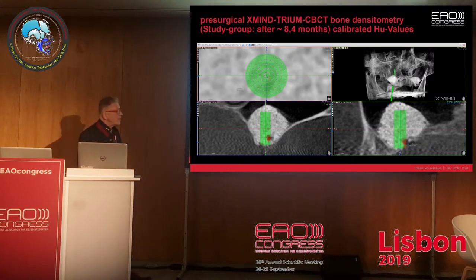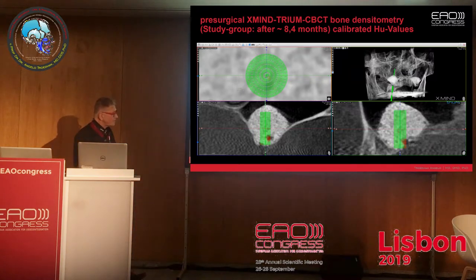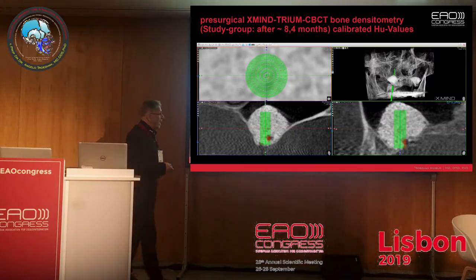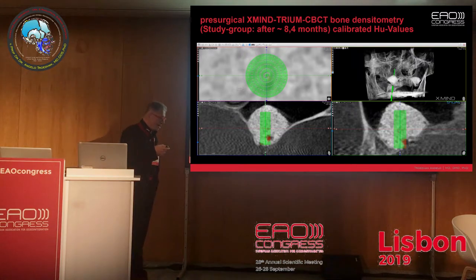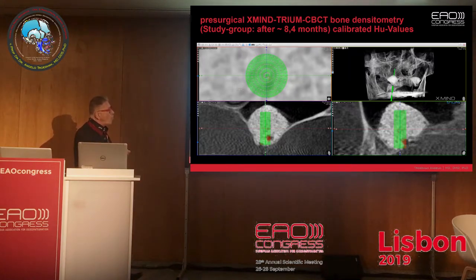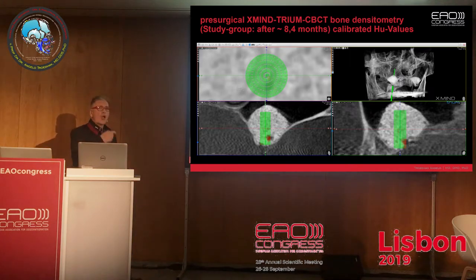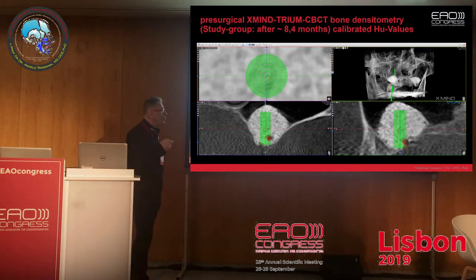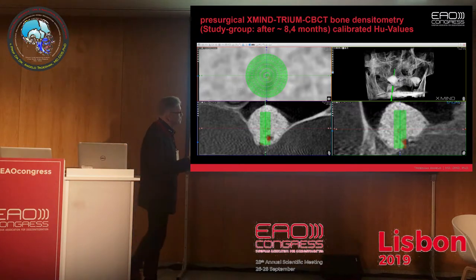Immediately before we inserted the implants, both in the study groups but also in the group presenting native bone, we investigated the bone density exactly at the spot where the implant was inserted. And of course, this is a calibrated procedure. We get number values, but for easier interpretation of the results, we also have a color scheme coding. That means the more light green the densitometry imposes on the CBCT pictures, the more dense the compound of natural regenerated bone with granulate or self-hardening biomaterial imposes onto these pictures.